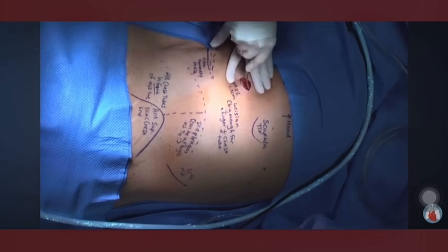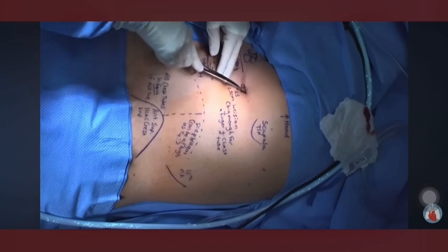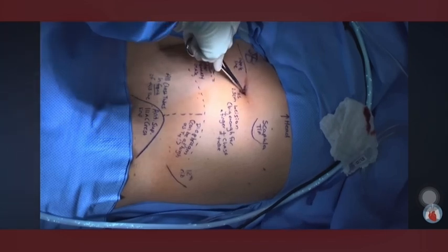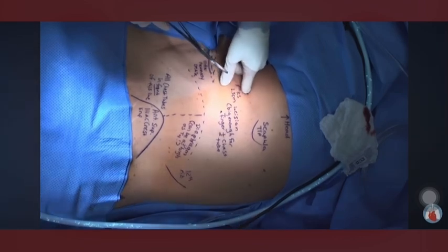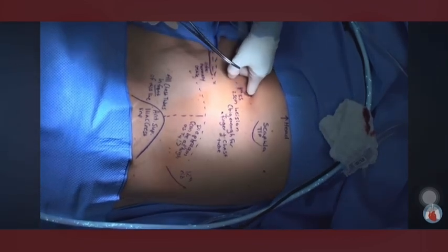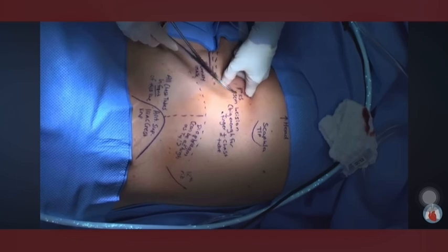Our incision is created. Blunt dissection is carried down to the chest wall. A finger can be used to help identify the top part of the rib. Remember that the intercostal artery, vein, and nerve run along the underside of the rib, and injury to these vessels can result in a significant amount of bleeding.